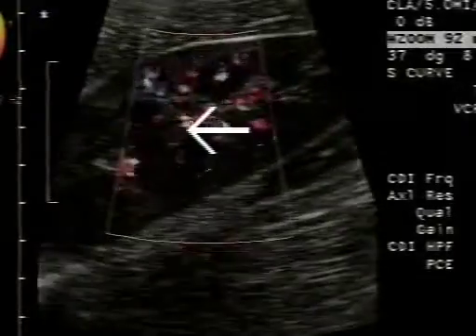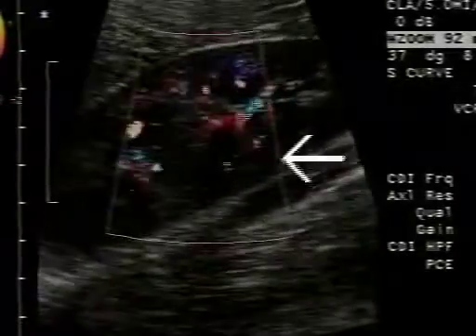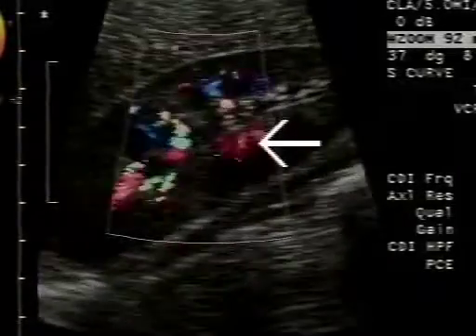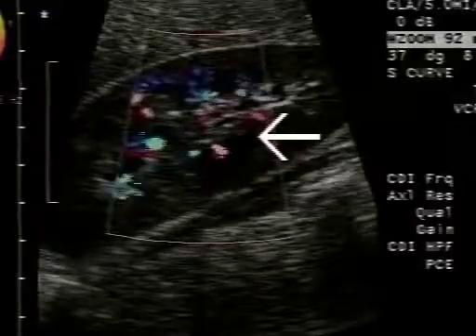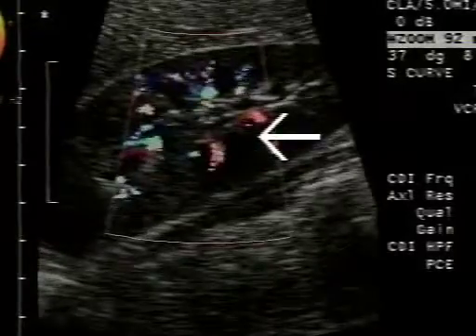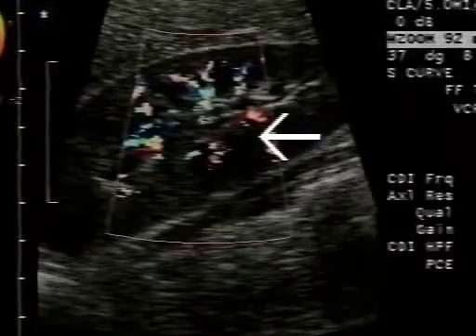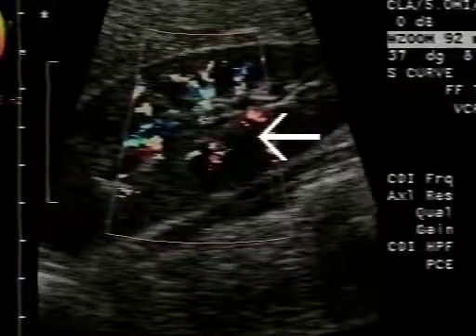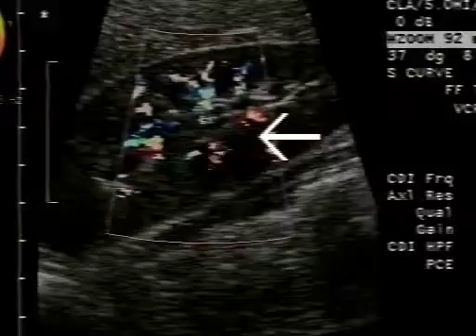And as we move to different segments, notice that there's very little liver in view here. Almost the entire image is taken up by the kidney, and that's what you're trying to do so that you'll get better color flow. And then when we drop our Doppler in the segmental renal artery, and we take a waveform there, I believe one will be coming up momentarily.